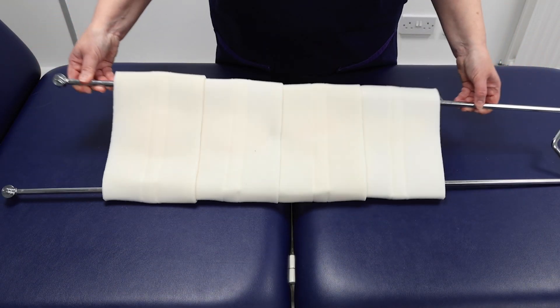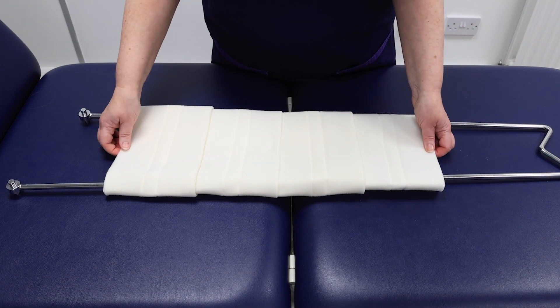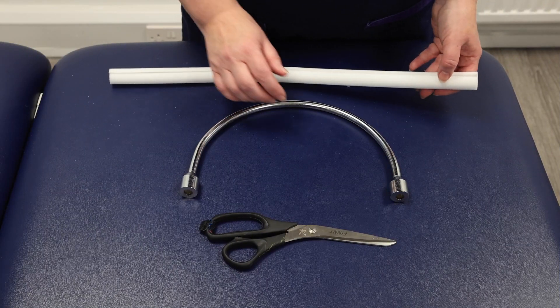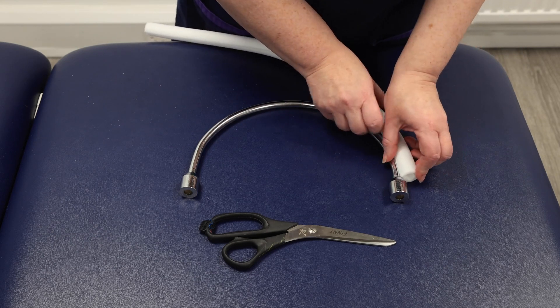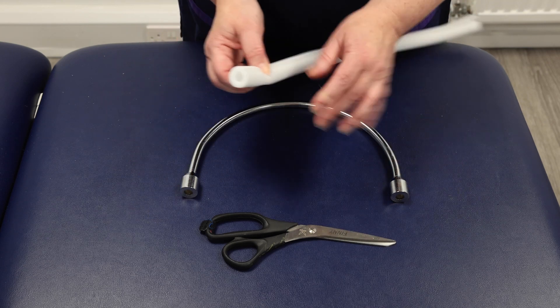Flip the splint over and adjust the sling position to provide optimal support. Then take the size three hoop ring and fit the padding tube, trimming it as needed.